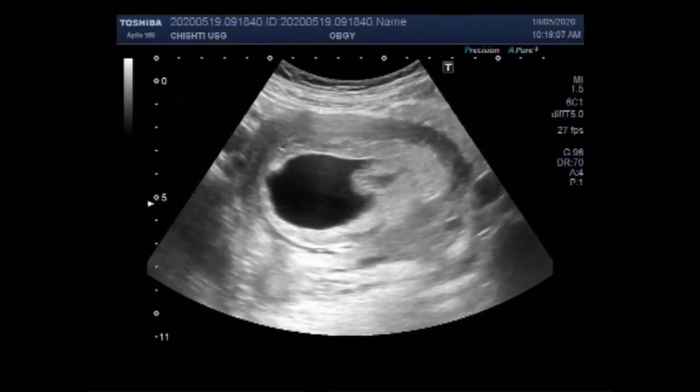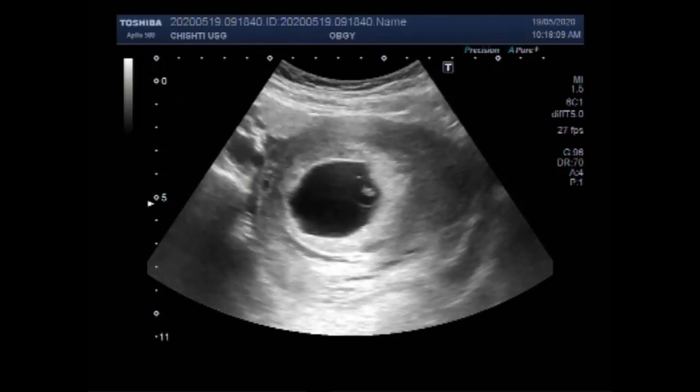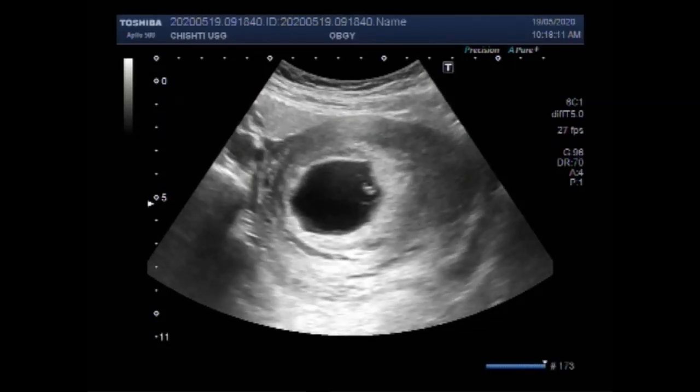You can see the gestational sac having a fetal pole and some products of conception.